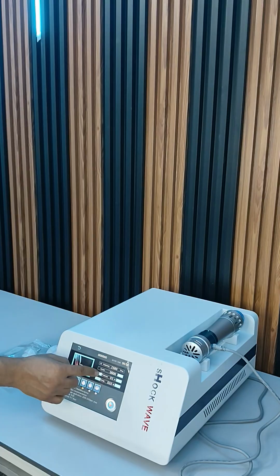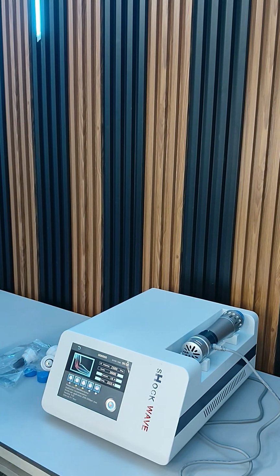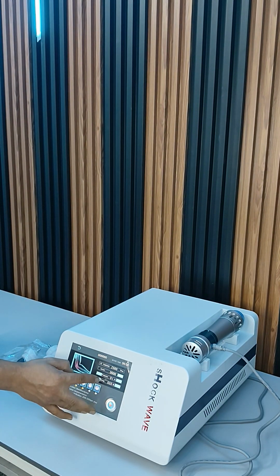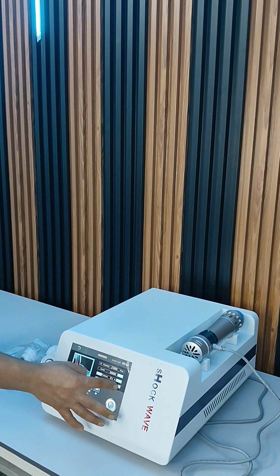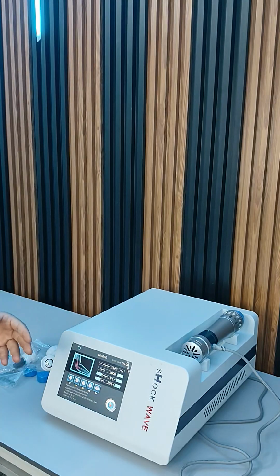You can vary the frequency from 1 to 16 Hz, and if I make it 1, you can go for energy from a minimum of 5 millijoule to 200 millijoule. But if you select a frequency from 1 up to a certain level, not the maximum, you can go for energy up to 200.